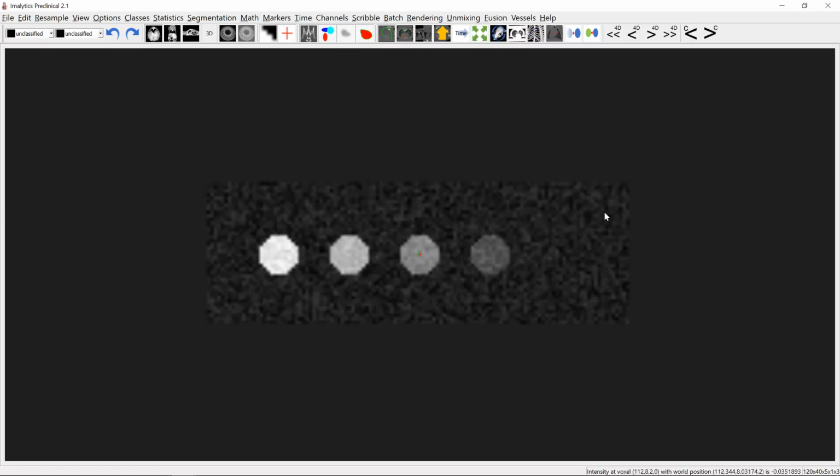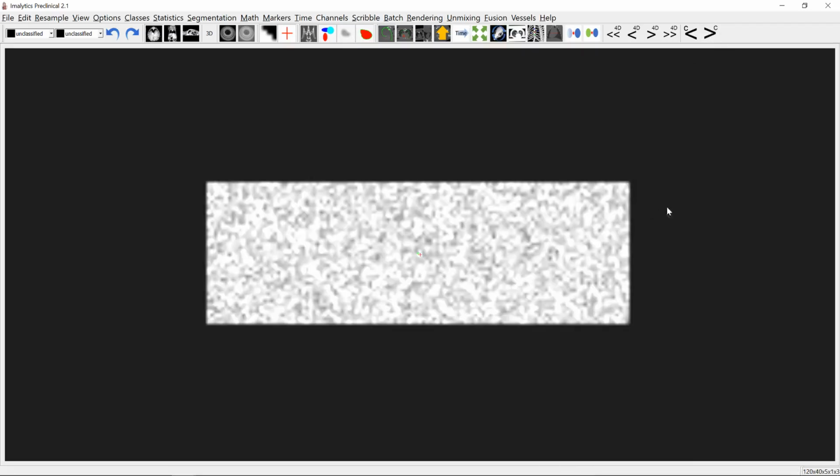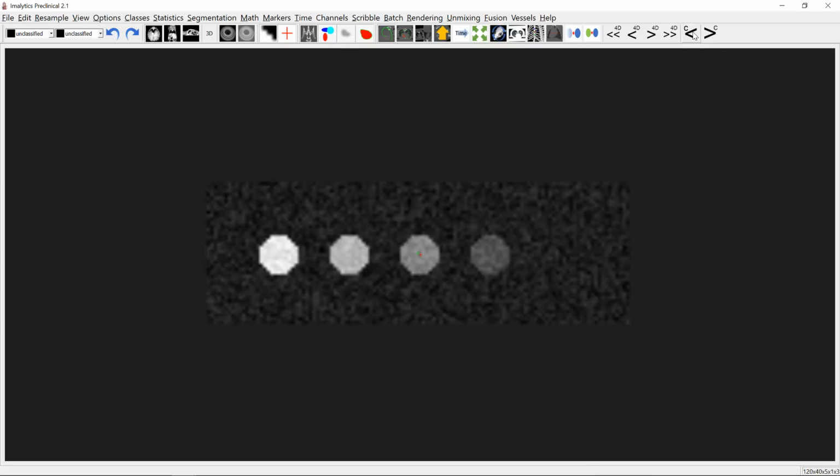And so this shows the first component, and we see that here we have these 5 wells, and here we actually don't see anything, and that's good because there is nothing in there. And if we go to the other channel here, it's the other way around, and there's a last channel also. This is just the background it computed.